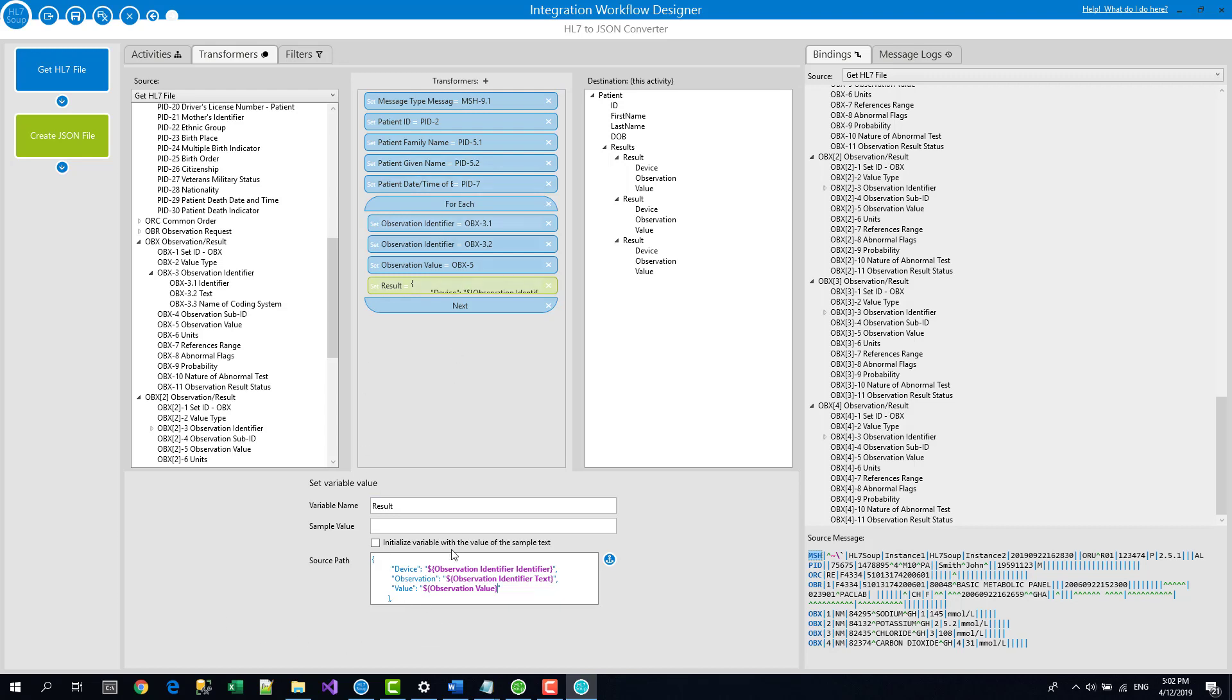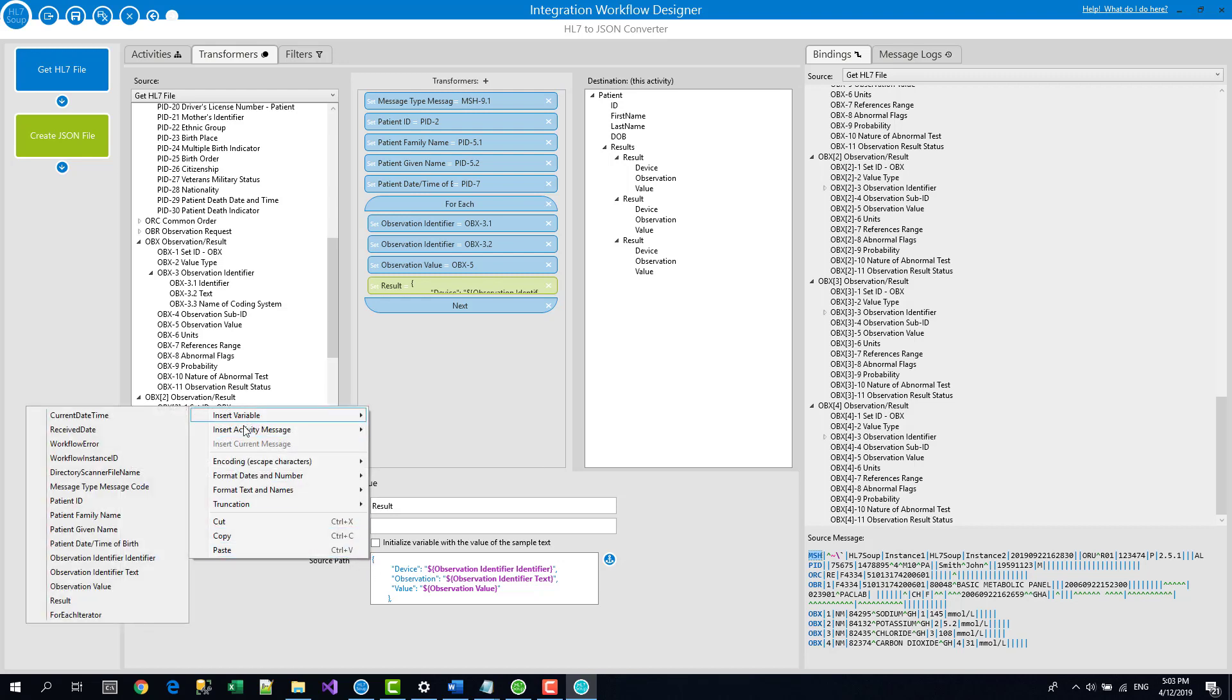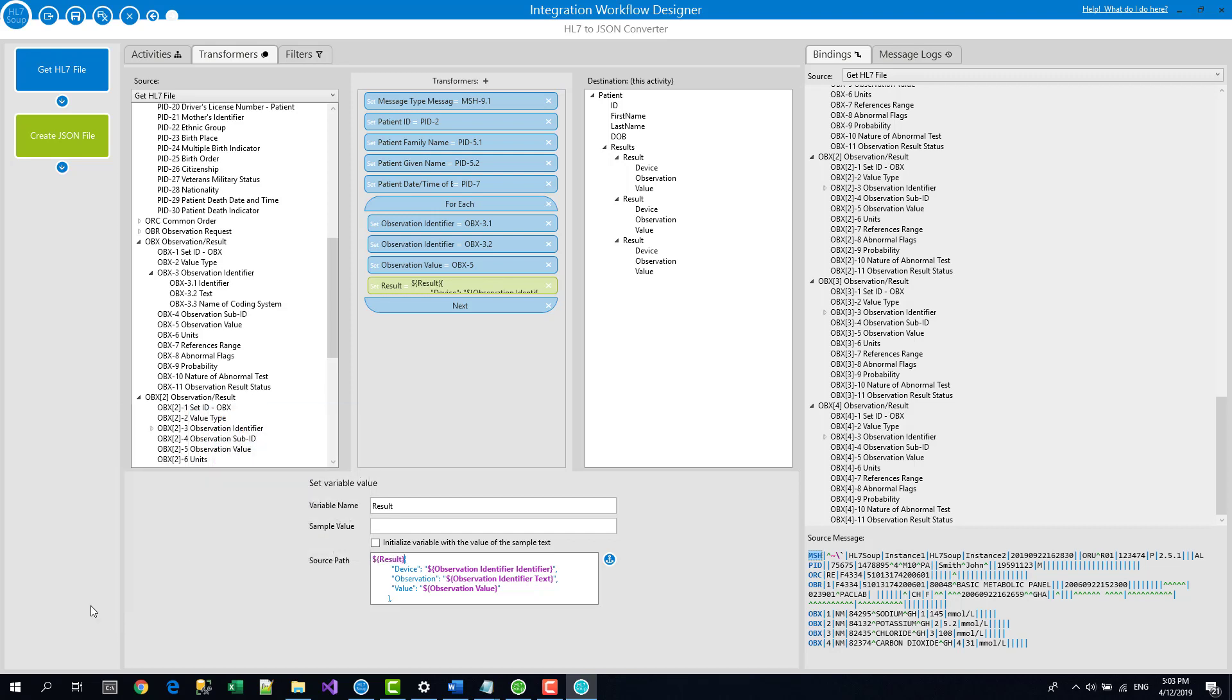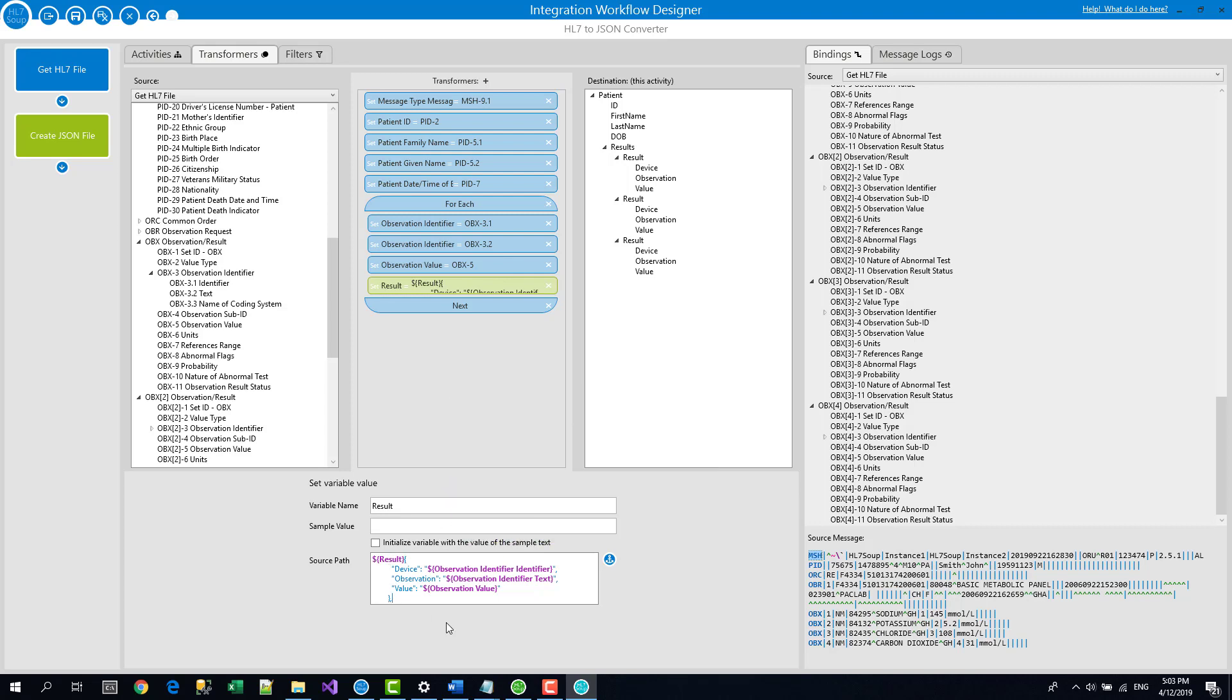So now it's going to loop over and it's going to build up this text. But of course, that would put the same value again into the same variable. So we want to make sure it appends to it. So what we do is we just put the values that are currently in that variable first. So I just go to that. So what it's going to do is add the new result to whatever results we already have. Okay, so that's going to build up a list and then it's going to have a comma after each one.